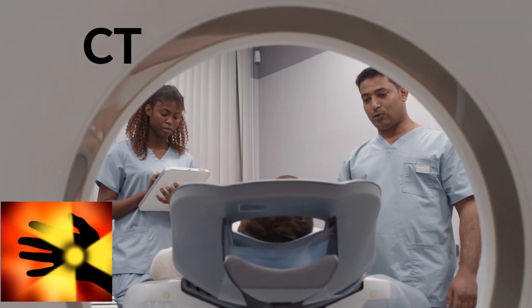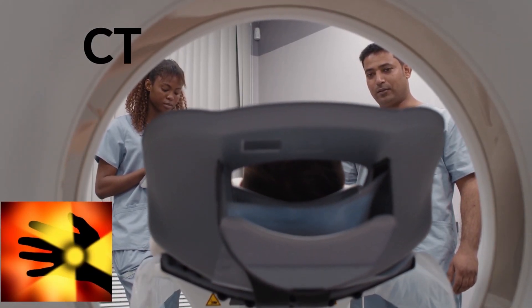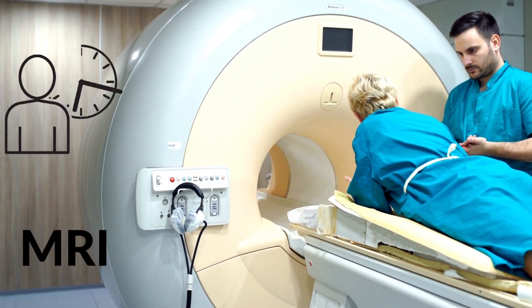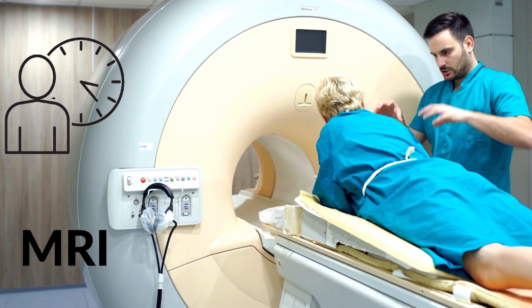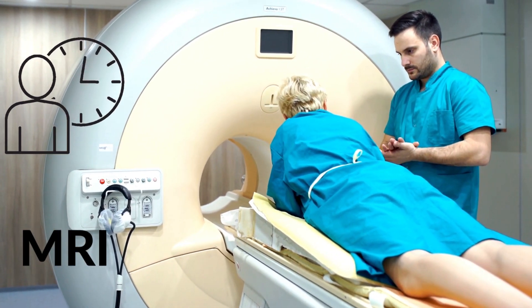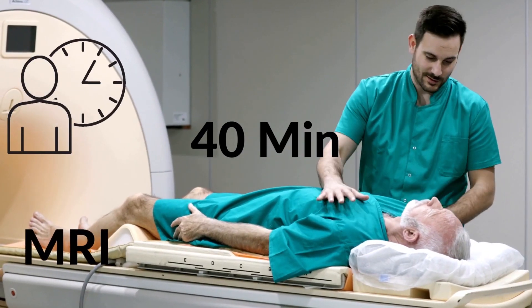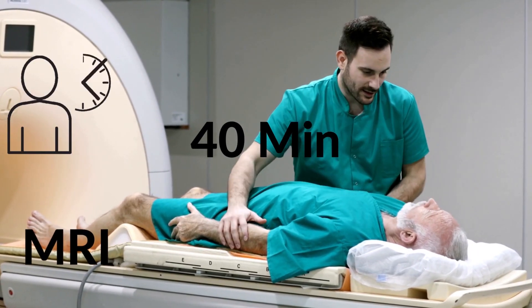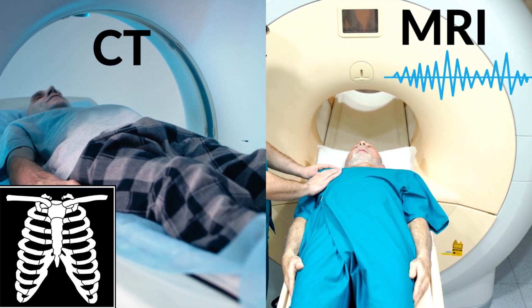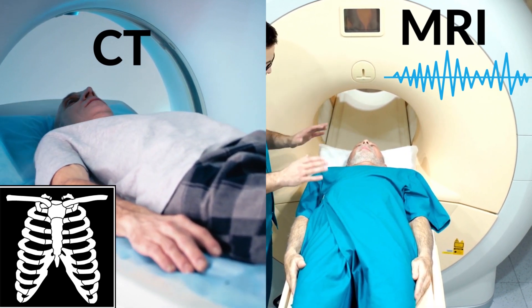CT scans briefly expose patients to radiation, while MRIs do not. MRIs may take longer than CT scans. The length of time depends on the part of the body being imaged, but an MRI can take anywhere from 10 minutes to more than an hour. The average MRI time is about 40 minutes. The biggest difference between MRI and CT scans is that MRIs use radio waves while CT scans use x-rays.